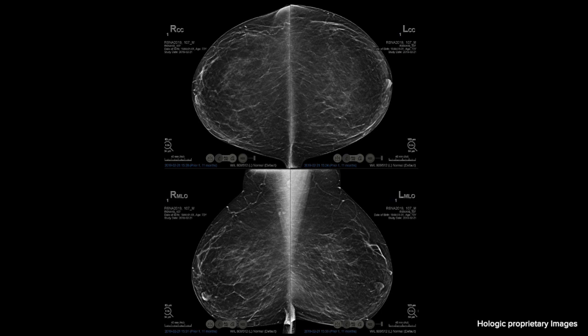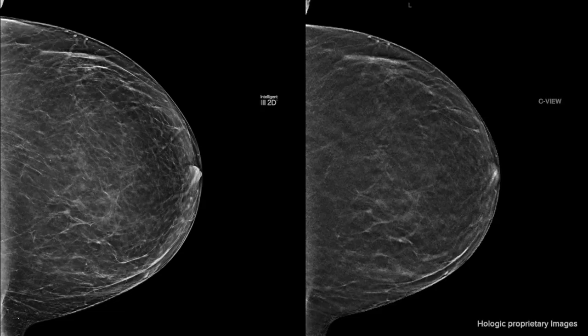The images can be viewed on a three megapixel monitor and then can be split. Here you can see the CCs on the top and the MLOs on the bottom. The screen can also be split into two. On the right of the screen you can see our original synthetic 2D image Seaview, and on the left you can see our new synthetic image called Intelligent 2D. Intelligent 2D is a 70 micron resolution image that looks more like your standard 2D image with improved skin line and contrast.